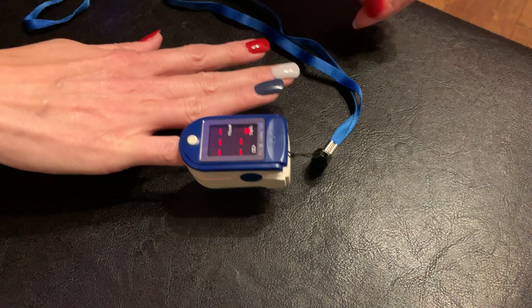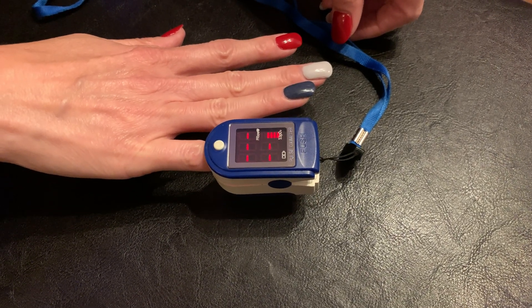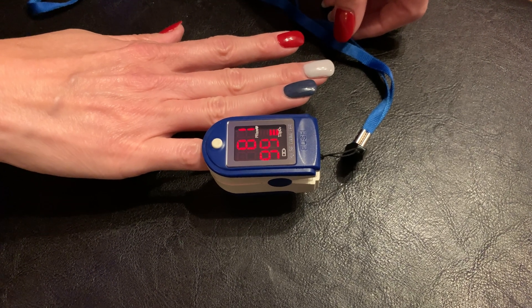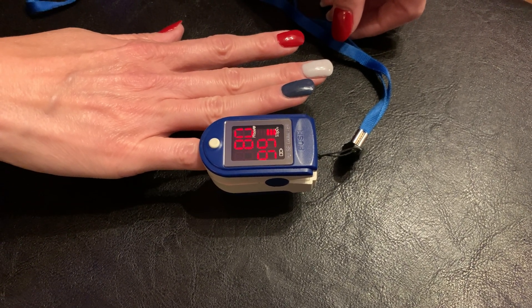Let's see what the pulse ox shows on her different fingers. We have one without any nail polish and then she has three different colors. This first finger has no nail polish at all — you can see we're getting a pulse reading of 99% and a pulse rate of 80. Looks good.